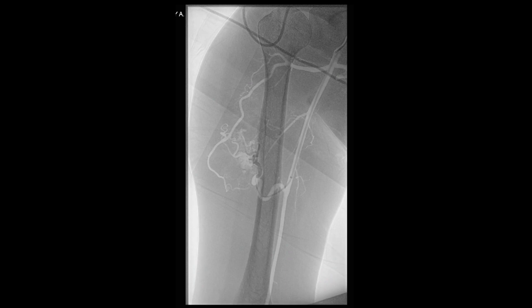We then begin performing onyx embolization of this arteriovenous malformation. Care is taken not to perform this rapidly, as it can lead to potential embolization towards the venous system and into the heart, and also to protect onyx from embolization towards the arterial system — in this case from the brachial artery distally into the radial and ulnar arteries. For the demonstration of this video, onyx embolization has been sped up, although it is performed slowly for the previously mentioned reasons.